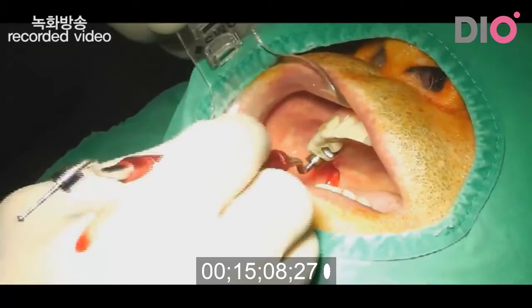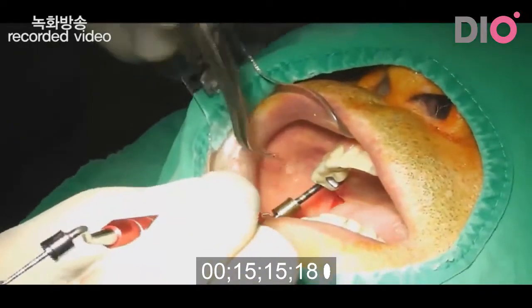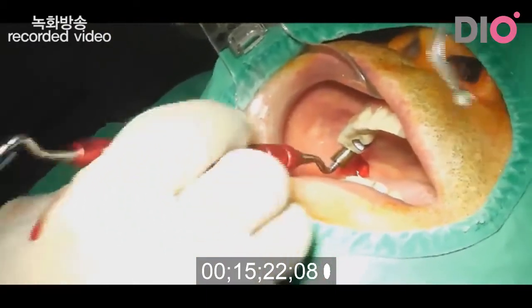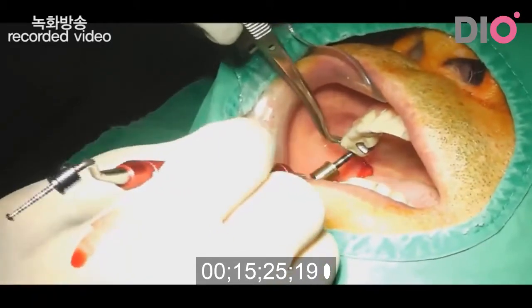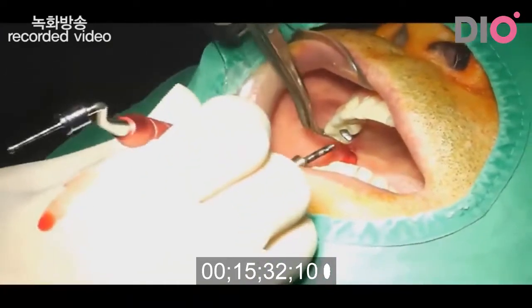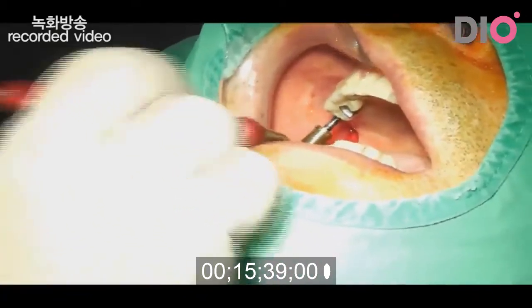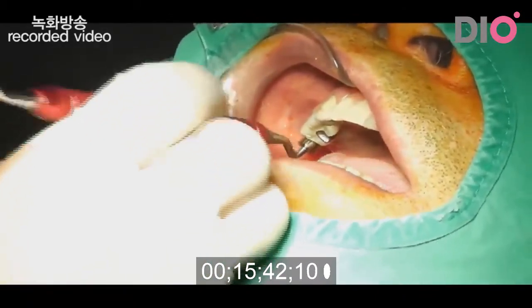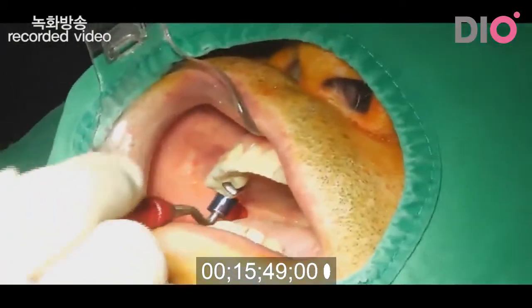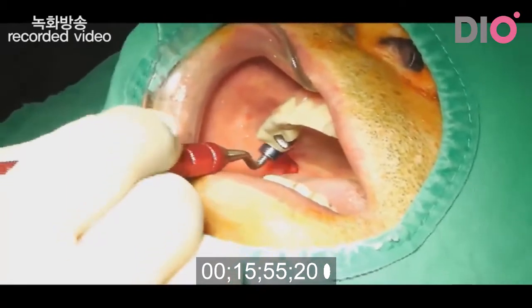The procedure is the same as in the second molar area. The sponge is very soft, it's easy to insert. You have to use this stopper to control the depth of using this instrument. And then after inserting half of the material, I spread the material in the sinus cavity using the sinus curette.